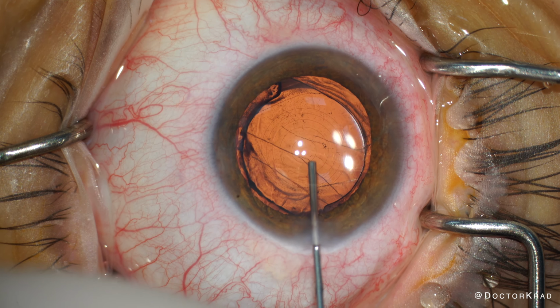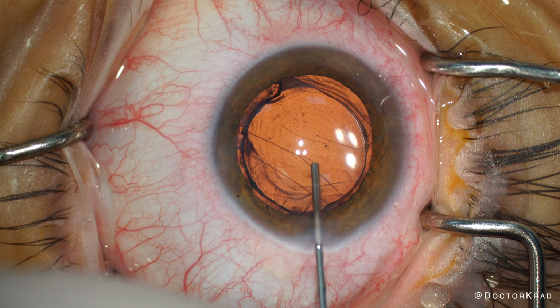Here I'm administering some intracameral preservative-free lidocaine with epi, and then followed by viscoelastic. This is dispersive. I'm inspecting the eye, and I thought I was going to see the CTR at one of these peaked areas of the capsule, but I don't see it.